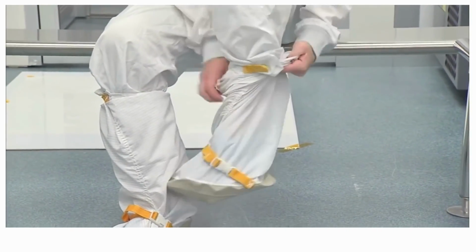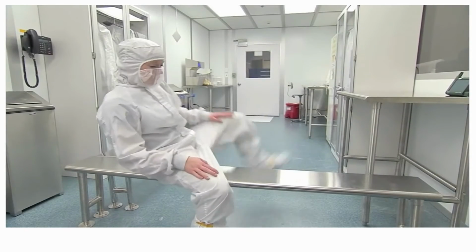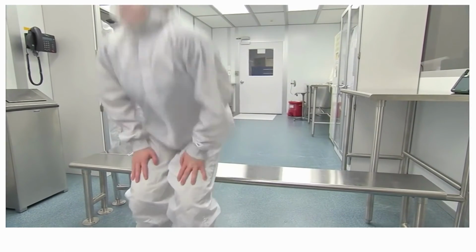Secure any snaps and tighten all straps for a proper fit. Then swing one leg over to the clean side and then the next. Then stand up.